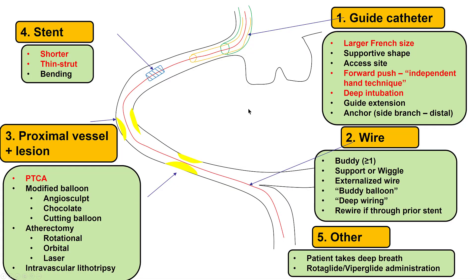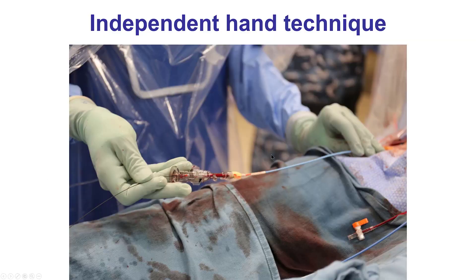Multiple things we did to achieve the delivery: we used the 7 French guide, the independent hand technique, and we tried to deeply intubate the guide — though of course there is the risk of dissecting the LIMA, so that should be done with care. We also used a relatively short, thin strut stent and predilated the lesion. But the key for successful delivery in this case was the independent hand technique: the left hand was supporting the guide catheter, keeping it in place with forward pressure, while at the same time the right hand was providing steady push on the stent to make it through the tortuosity.